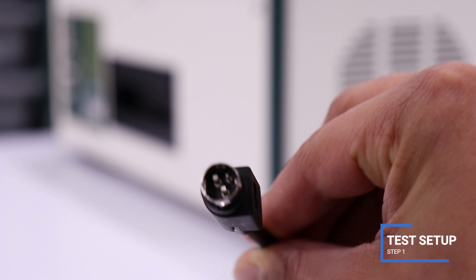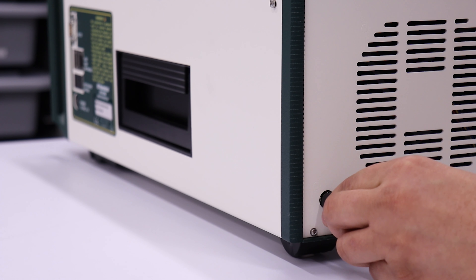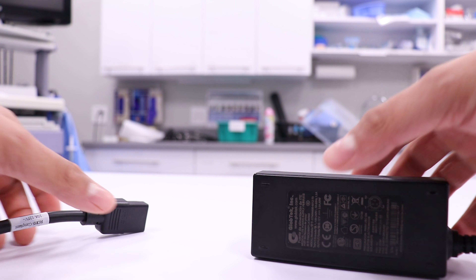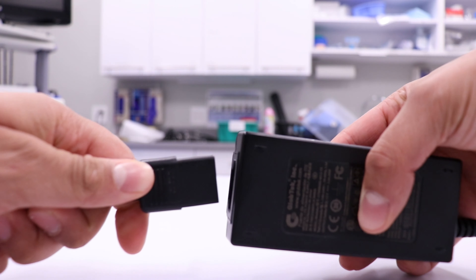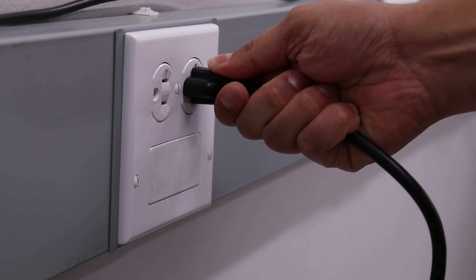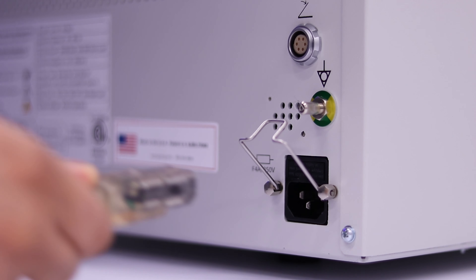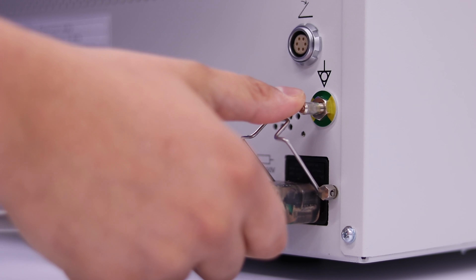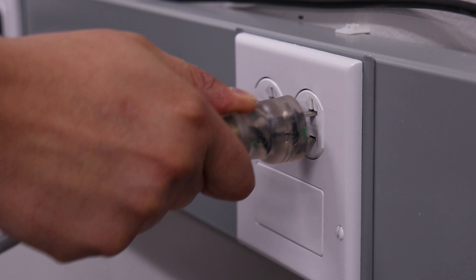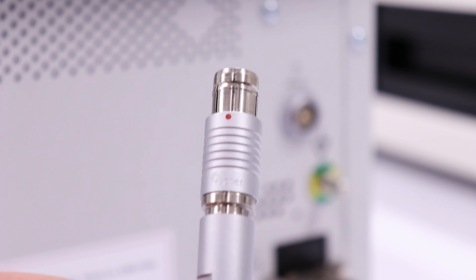To begin this test, plug the DC power adapter into the analyzer. Plug the AC power cord into the DC power adapter. Plug the AC power cord into a wall source. Plug the AC power cord into the GI-4000. Plug the GI-4000 into a wall source. Connect the GI-4000 footswitch.